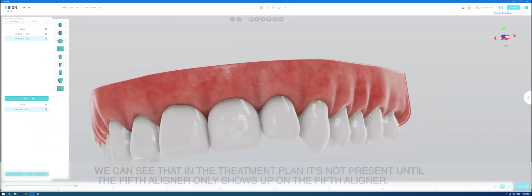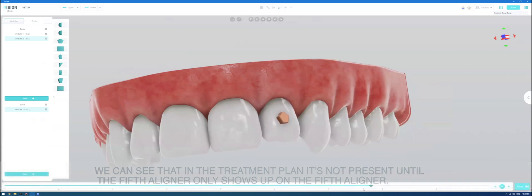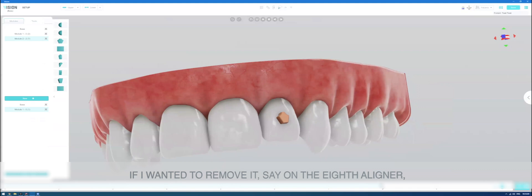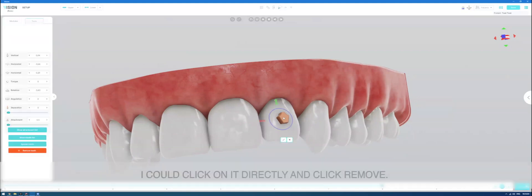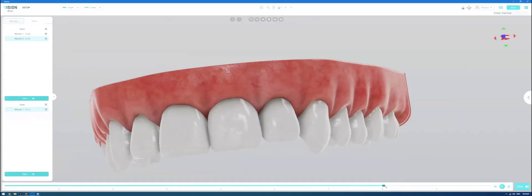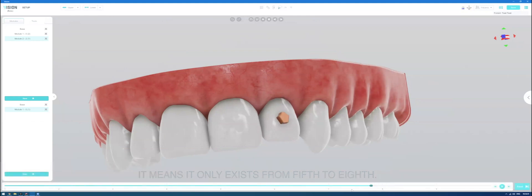And we can see that in the treatment plan, it's not present until the fifth aligner and only shows up on the fifth aligner. If I wanted to remove it, say, on the eighth aligner, I could click on it directly and click remove. It means it only exists from fifth to eighth.